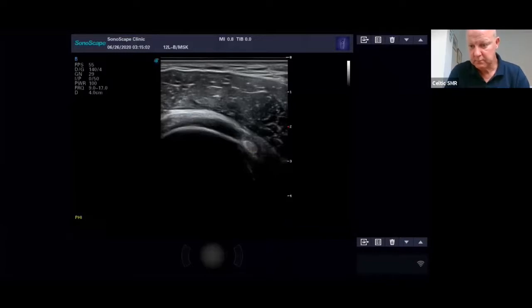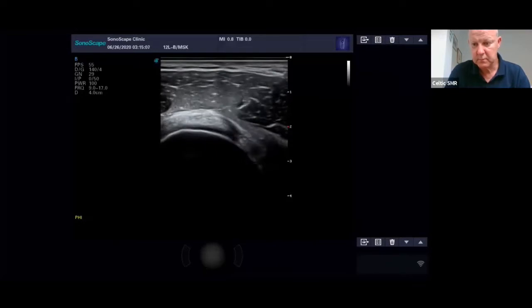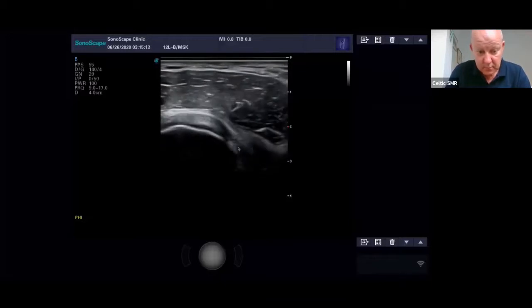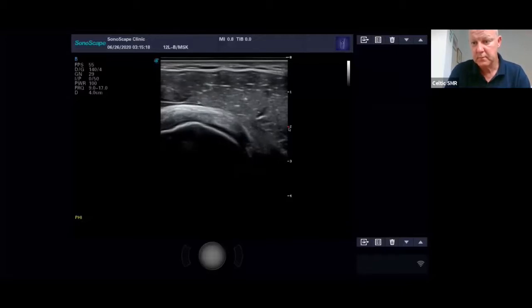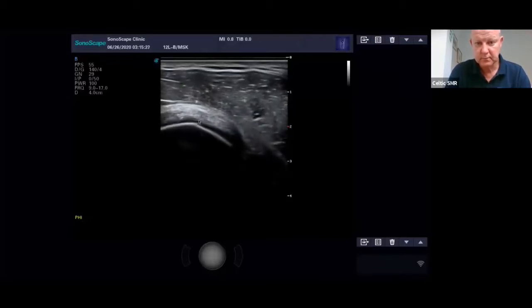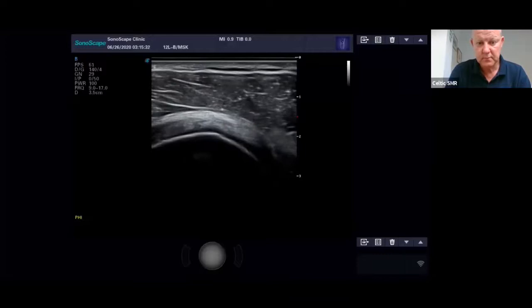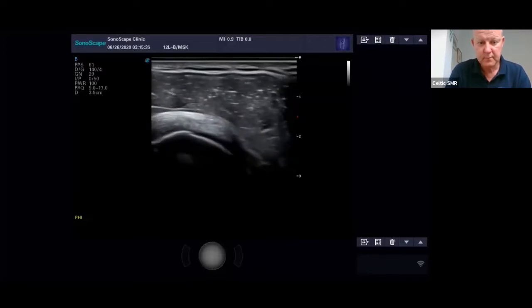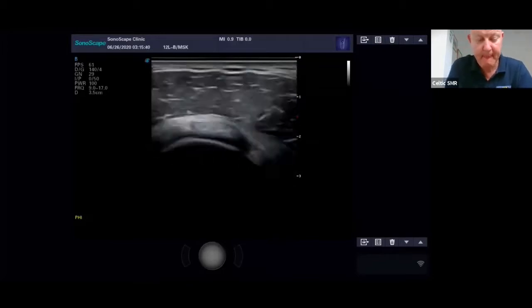Okay, so now I'm optimized for the supraspinatus, which is here, and I've got my biceps tendon as a landmark here. Here I've got the focus at the same level, which gives the best image quality. And the depth I've got probably optimized, maybe go one more. You want to use as much real estate of the screen as you can, and therefore you can see as much as you can.